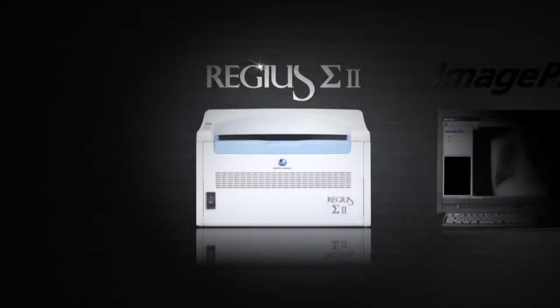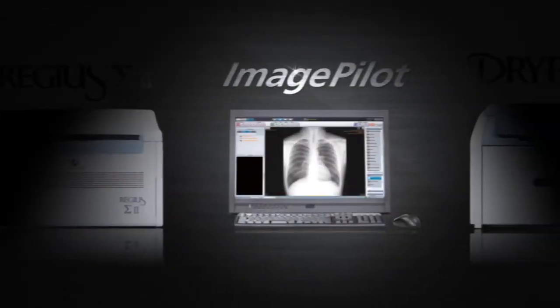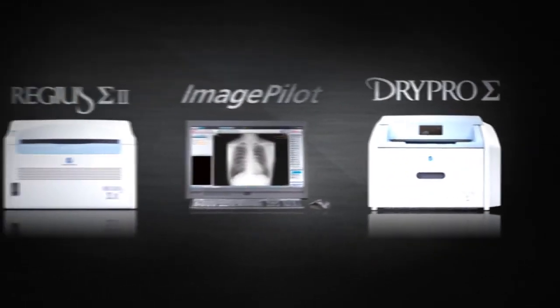Konica Minolta's smallest and lightest CR solution, the Regis Sigma, ImagePilot, and small but powerful laser imager DryPro Sigma, provide a simple yet versatile transition to digital radiography.